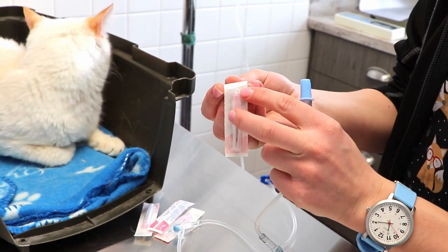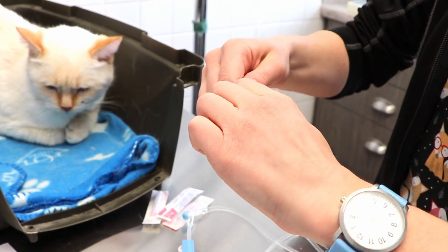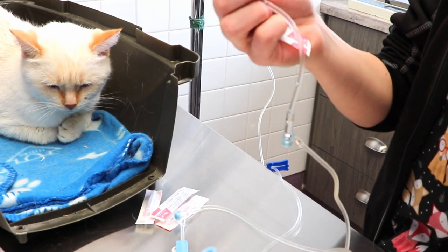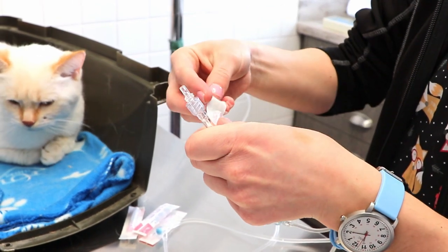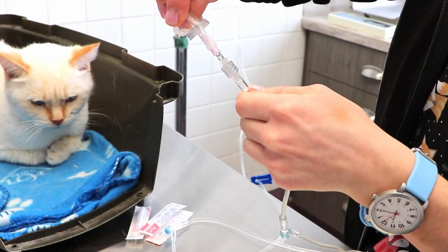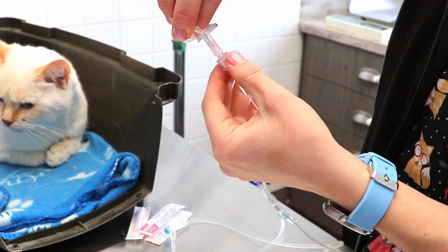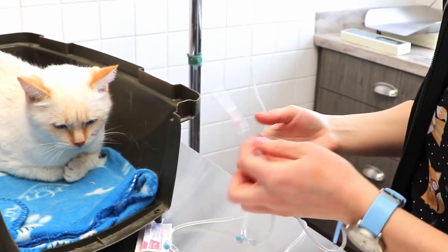This part stays sterile because it's sterile in here, and then you'll want to make sure when you take this off that this part stays sterile. So just open this up and then stick it on there, and then this part just twists on just like that.